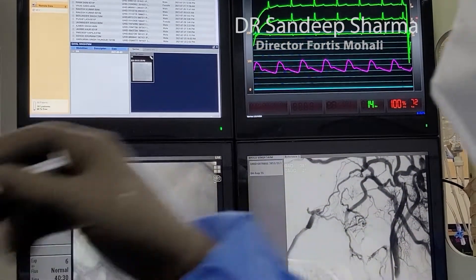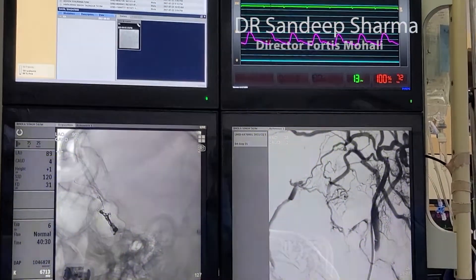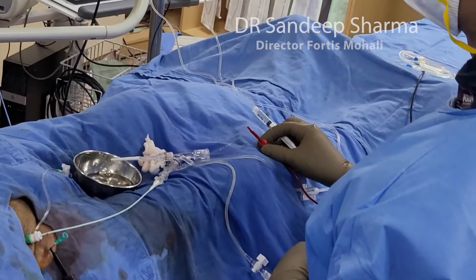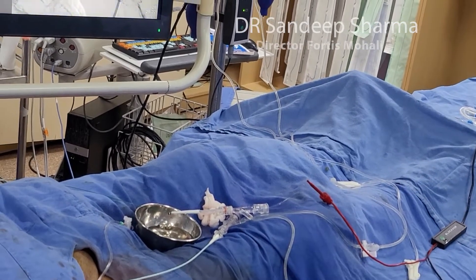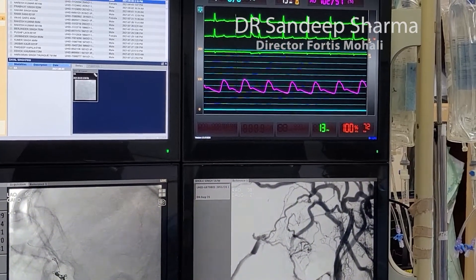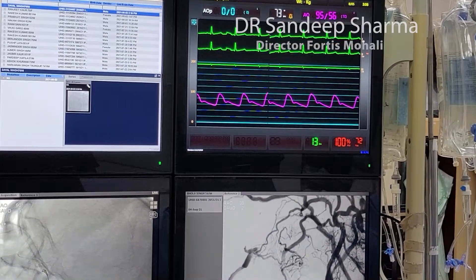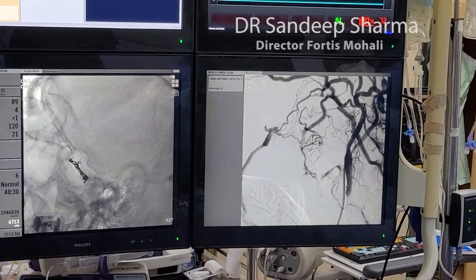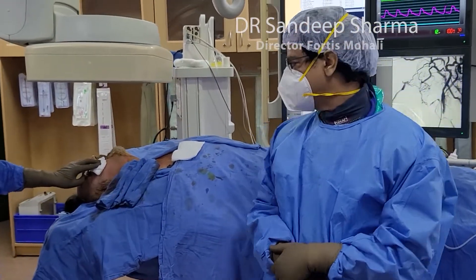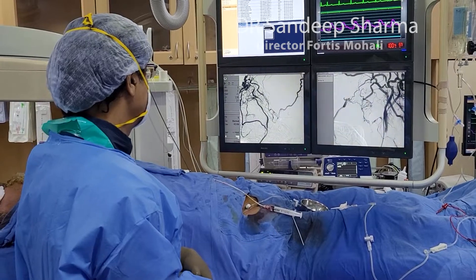Partial detachment — we would like a more definitive one. The problem was the superior ophthalmic vein was not filling, possibly due to too much wire manipulation; it is difficult to enter. There's a little blip in the ECG — we are used to a little more. We used instant detachable coils. We are done — this is our run through.